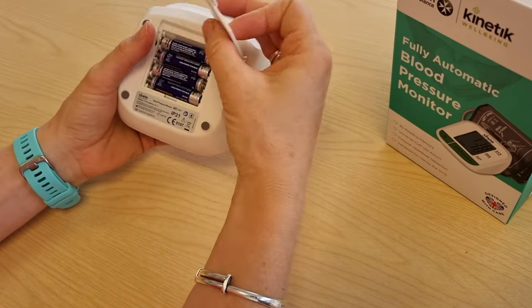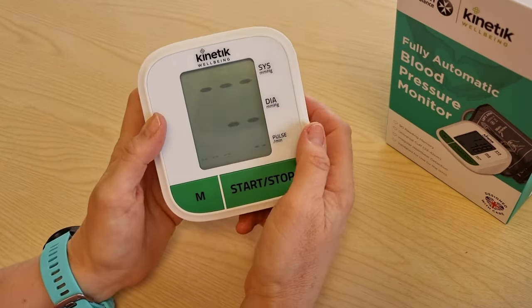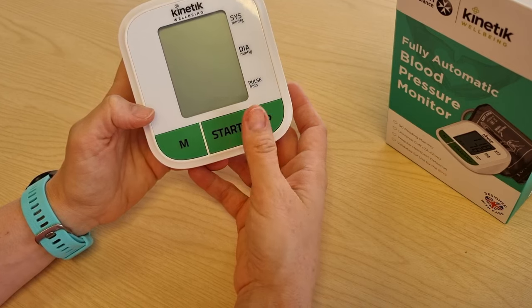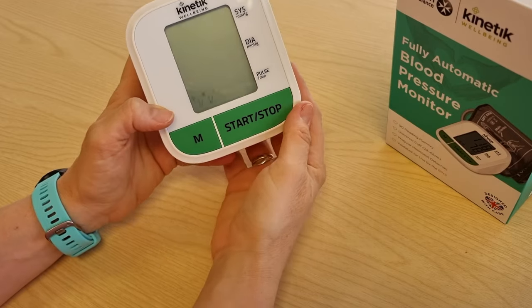Make sure you slide it down and the unit will automatically come on. You will hold the start/stop button until the time, year, and date flash in the corner of the screen.